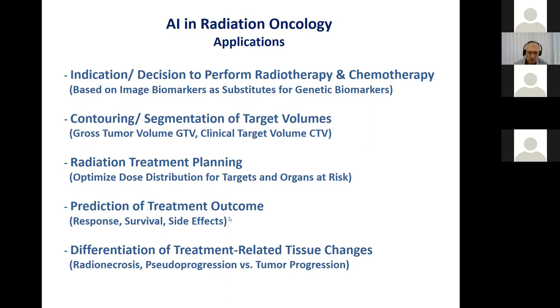And then once you have started treatment for the patient, you may want to predict the treatment outcome. And this is in terms of response. So will the tumor disappear or at least become smaller? You probably want to know if the patient has a chance to survive and how long, and also if he will experience side effects. And then after the treatment is over, you will do a lot of imaging. Mostly it's CT and MRI, but also increasingly PET is used. And then you will often see changes in these images which are not easy to interpret.